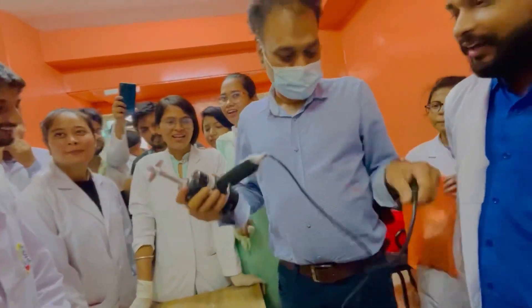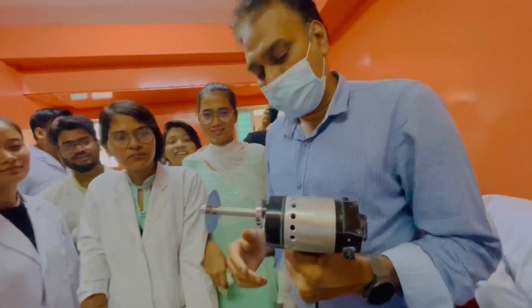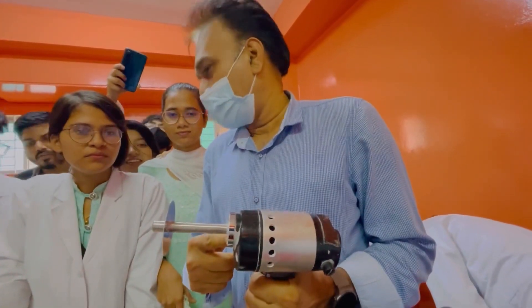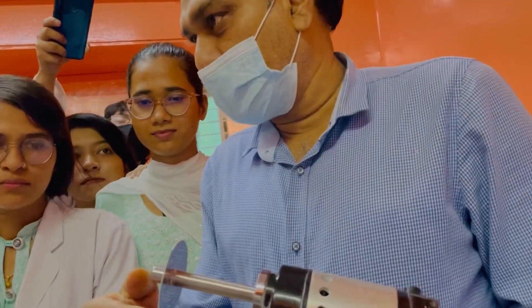It's a power drill and a cutting saw. This is electric. When you have a cutting saw, it's a saw.